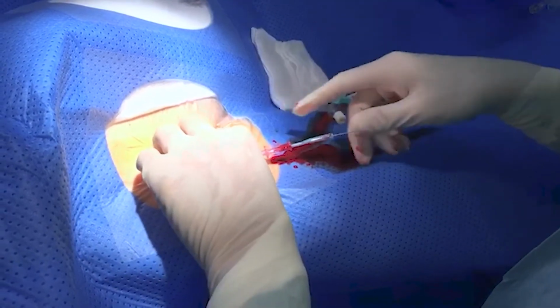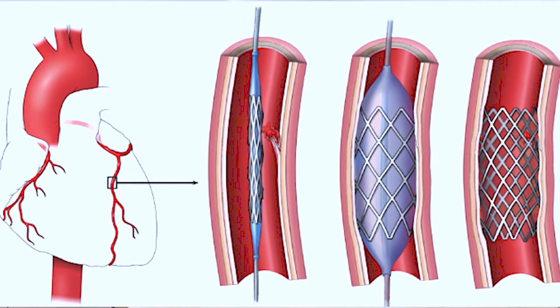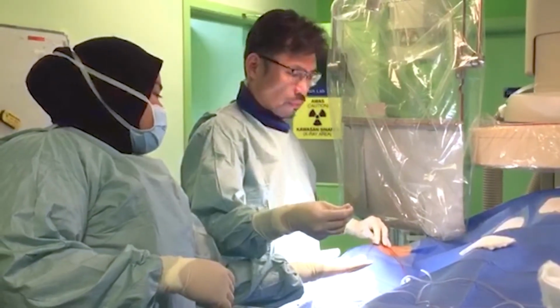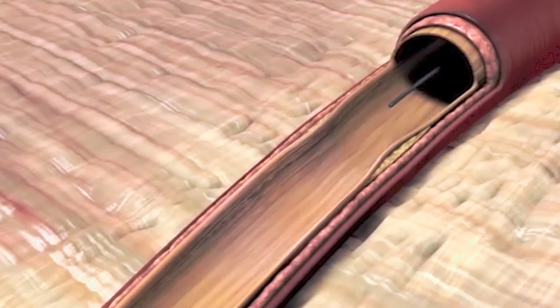During the angioplasty procedure, which is done under fluoroscopy, a wire is passed across the stenotic lesion, i.e. across the blockage. Through that wire, a balloon catheter is passed and placed across the lesion and then inflated at high pressures. The inflator, which is positioned outside the body, is inflated at up to 8 to 12 atmospheres to crack open the stenosis. Once the balloon has cracked open the blockage, the balloon is then removed, just leaving the wire in place. Sometimes multiple inflations are required to open up the blockage, and sometimes you may even require several balloons to crack open the narrowing.